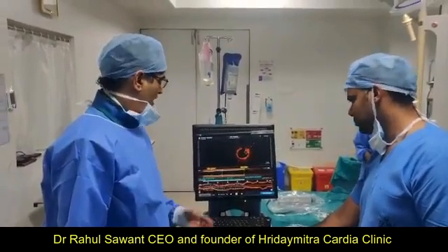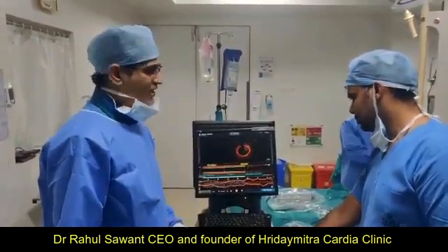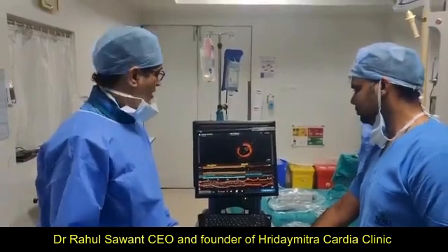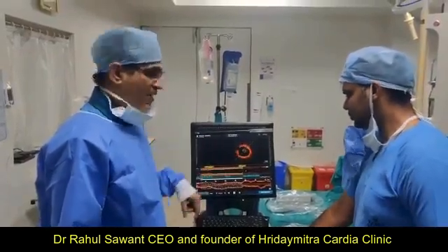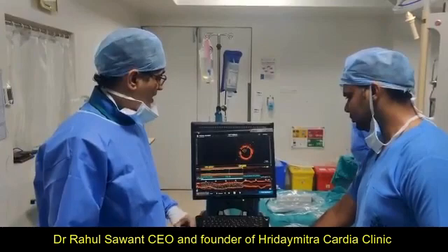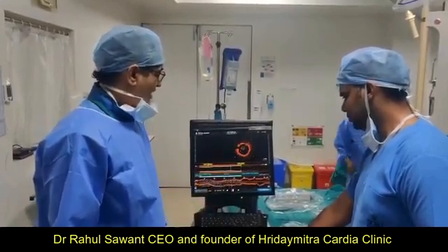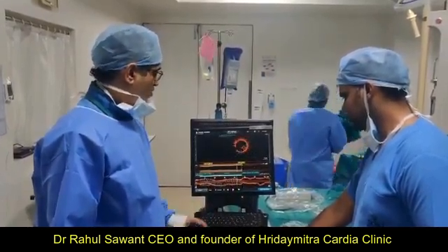The advantage of this system is you can see clearly from inside the vessel. You can see how much is the diameter of the vessel, how much is the expansion of the vessel, and if there are any dissections at the edge of the vessel.